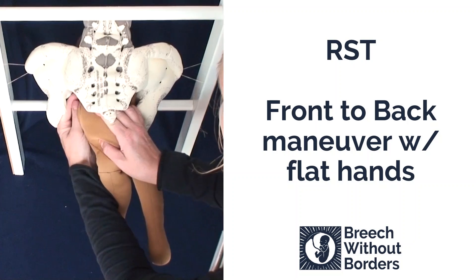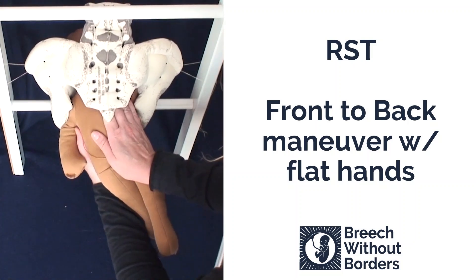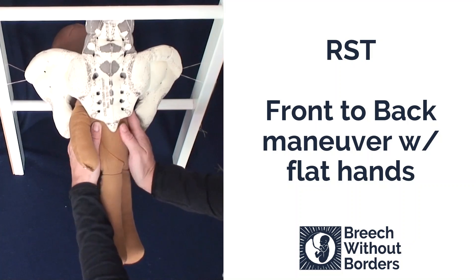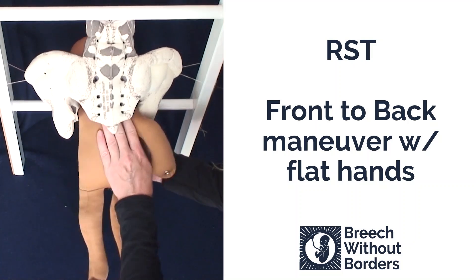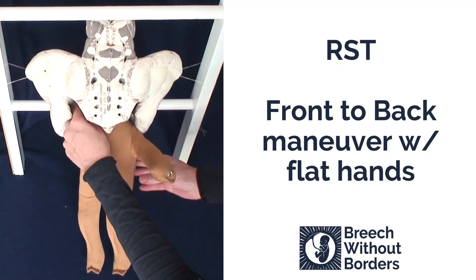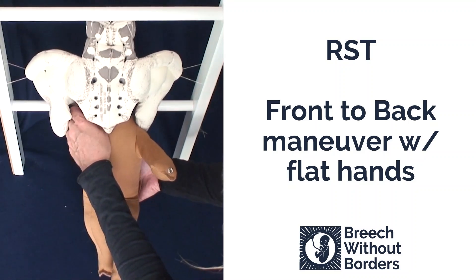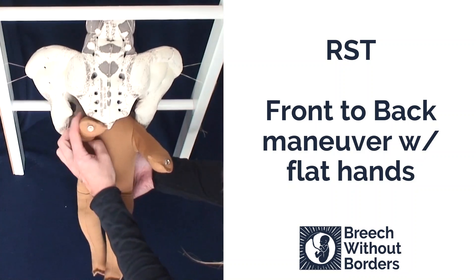With your bottom hand, sweep down the anterior arm. Then rotate 180 degrees back to face you. You might have to sweep the second arm down, putting gentle counter pressure under the baby's bottom so you don't accidentally pull the baby down.